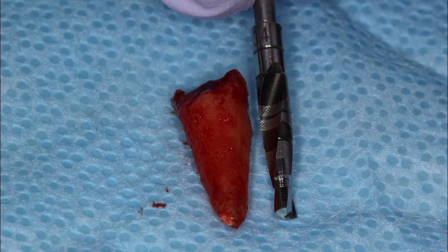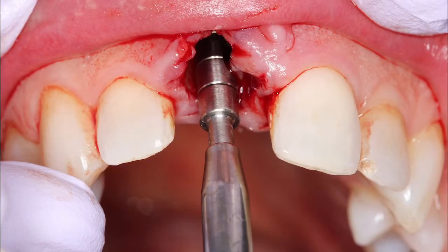In Figure 5, we show that the root anatomy was assessed to determine the appropriate length of the subsequent implant. The facial-lingual and mesial-distal dimensions of the root were evaluated so the tooth could be replaced using the inclusive tooth replacement system. In Figure 6, we show drills being used, which are included with the system, and these were used to prepare the extraction site for the dental implant.